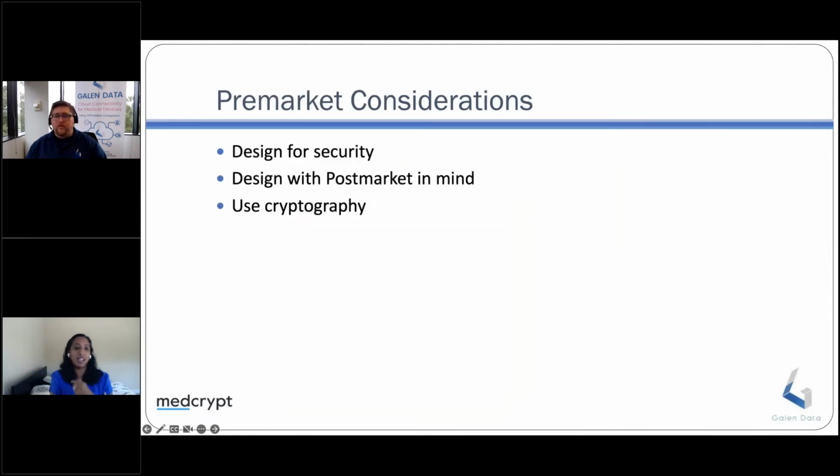So they make an explicit call out for design for security. This notion is that your devices have to have consideration for how this interface is going to work in a hospital. Imagine you have a pump that's bedside, and to authenticate it, to manipulate some data, requires a 12-character long password that must have some combination of characters and special characters. That's pretty hard to enforce because you're in a healthcare setting. There are people having emergent issues and they have to be cared for imminently.